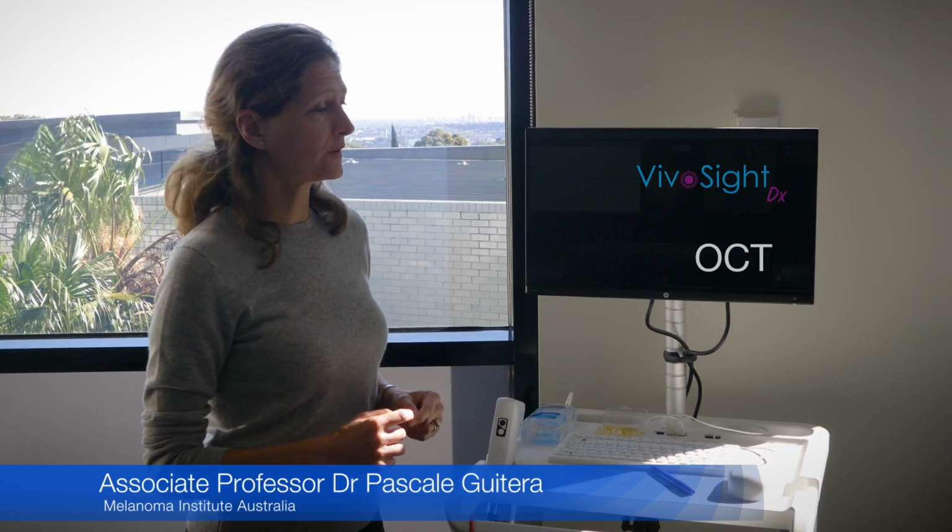Okay. And so the machine kind of helped you. It didn't obviously diagnose melanoma because you can't ask it to do that, but it helped you realise that there was something wrong there. Yes, but again, it's not a good machine for that, and I would not advise to use it for that. It's really on the triage of the BCC that I found it amazing, and then follow-up of treatment and mapping to know where the margins are, and recurrence when it's coming back and that sort of thing.